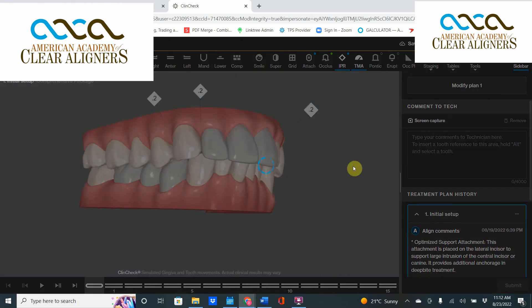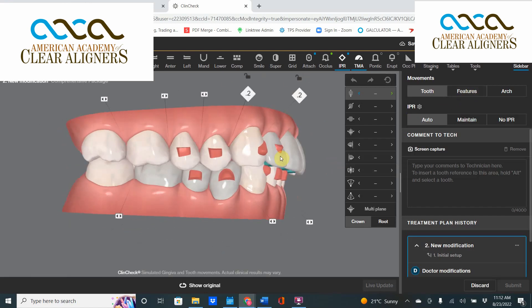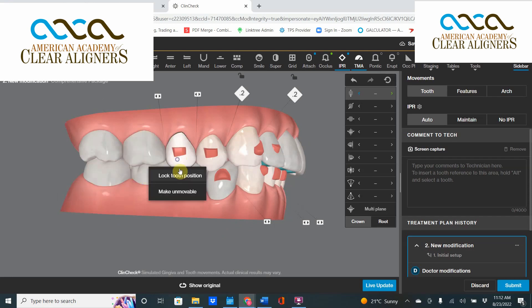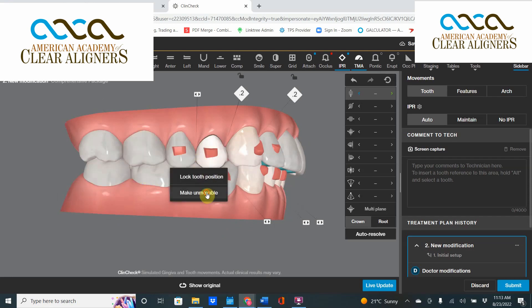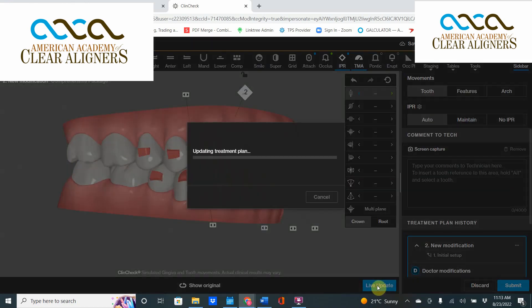Today I'm going to show you how to remove those movements. You go into Modify, and we're going to click on all these teeth and make them unmovable, unmovable, unmovable, unmovable, unmovable. That will take away those movements. Once I have that, I'm going to hit the button called Live Update and the system is going to update the ClinCheck to the new version. In the past, this was something you would need to have sent to the Invisalign technician and describe how you didn't want these herky-jerky movements that didn't really make sense in the overall occlusal scheme and treatment plan.